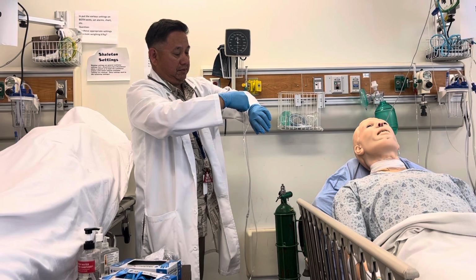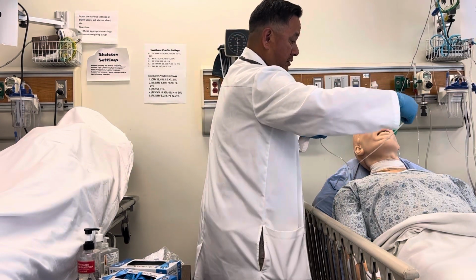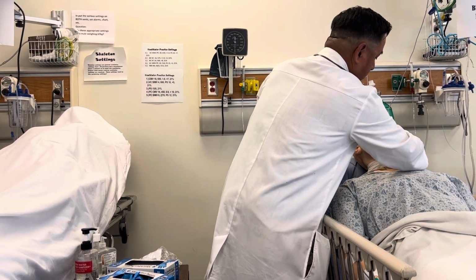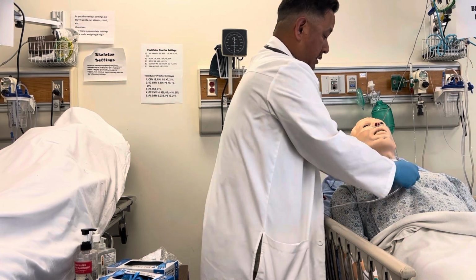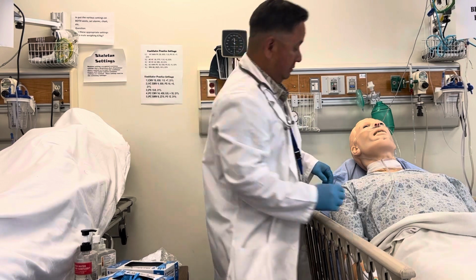Check to make sure that it's functioning. Okay, sir, I'm going to put these prongs right into your nose, just like that. Around one ear, around this ear. Cinch up under the chin.